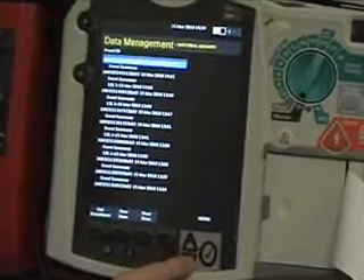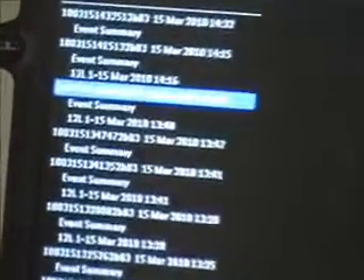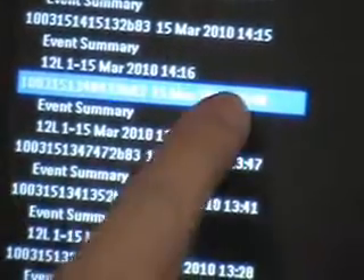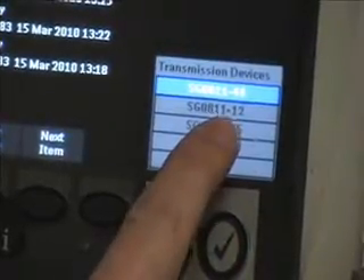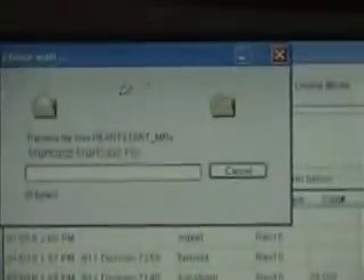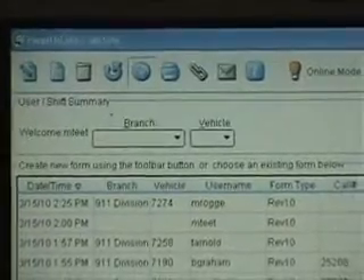Now we're in the data management menu. You navigate using these two arrows here — hit the next item and scroll down to a call that has a 12-lead so it has a bit more data. Say this is your call from two calls ago and you want to send it to the Toughbook. Highlight the call and hit Menu, then scroll up to Send. Your default is all event data — or you could just do the 12-lead — but in this case we're going to do all event data. Make sure it's the right Toughbook, number 44. We're just pushing the file over. It will confirm progress: 97% complete, confirmed, done.